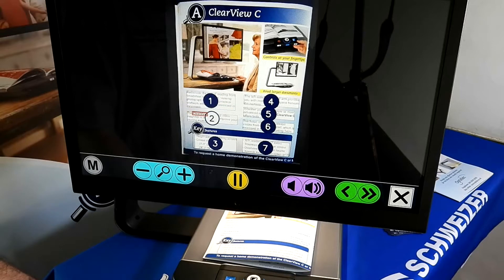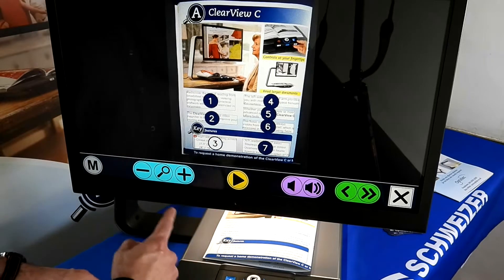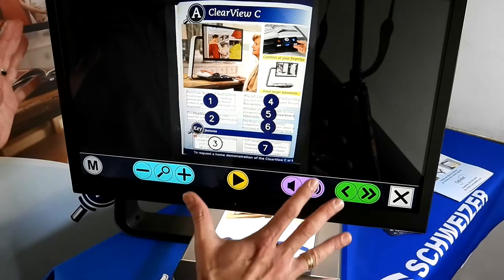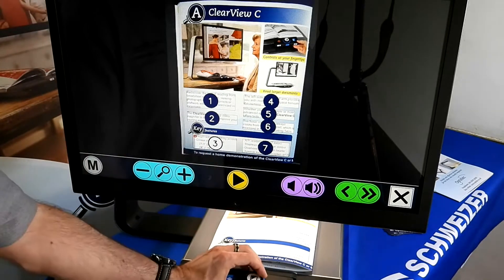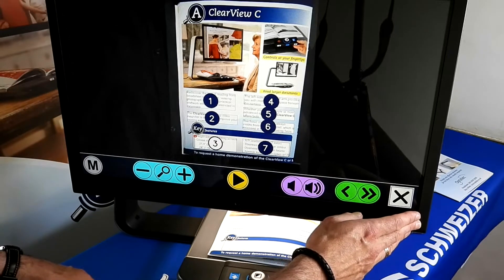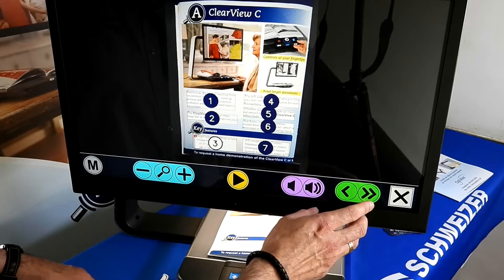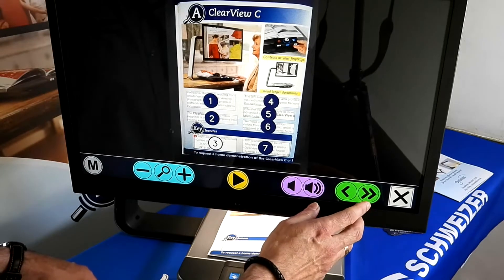You'll notice there is now a line of buttons on the bottom. They control the screen because in this speech mode it is fully touchscreen — you're not using the standard control part that you use for normal video magnification. From the right-hand side, the X just quits out of the application, allowing you to go back to standard video magnification. The green forward and reverse arrow lines control the speed, so you can increase or decrease the speed of the voice on the machine.